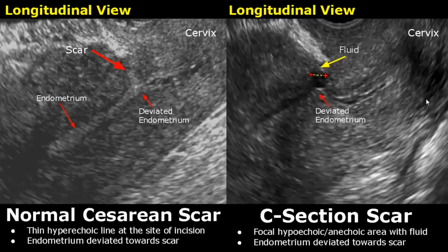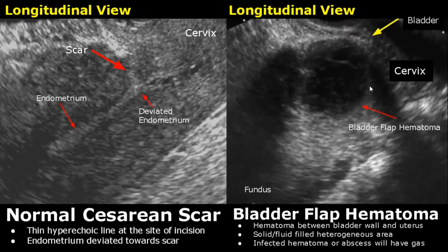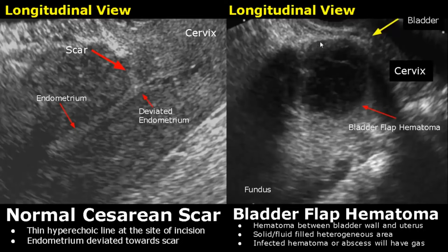These are the appearances of a caesarean scar. A bladder flap hematoma refers to a collection of blood between the bladder wall and uterus which can occur after a C-section. The bladder is anterior to the uterus. This hematoma will be heterogeneous with solid and fluid-filled areas. If it gets infected, gas will be seen — dirty gray posterior shadowing indicates gas.